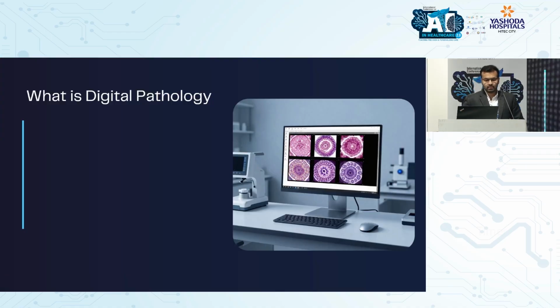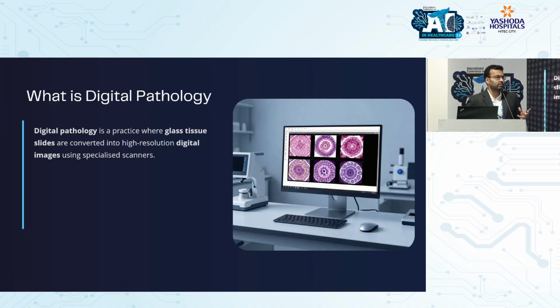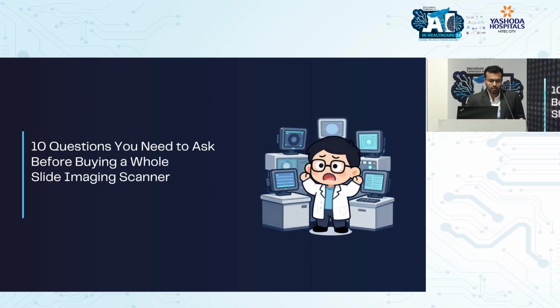So what is digital pathology? Basically, it is digitization of a glass slide, creating high resolution images, which can then be used for either telepathology, reporting on a screen, or running your AI algorithms, right? So 10 questions to ask yourself before deciding to buy a scanner.